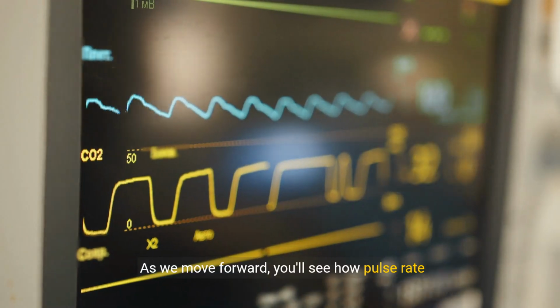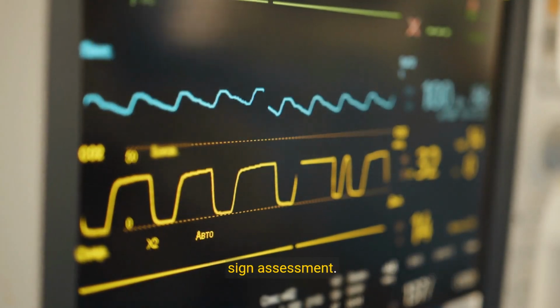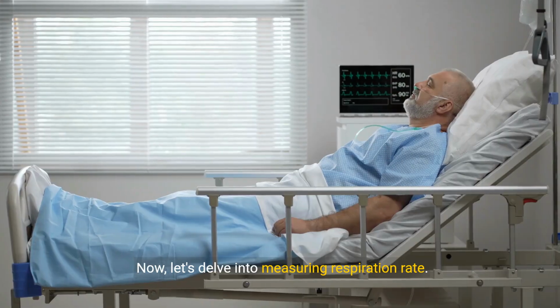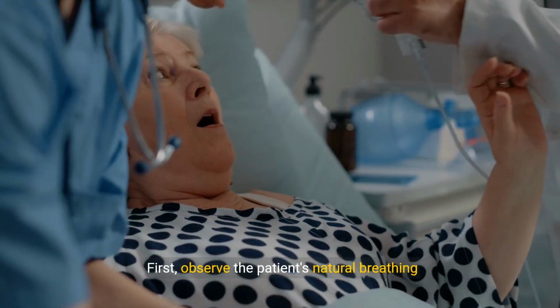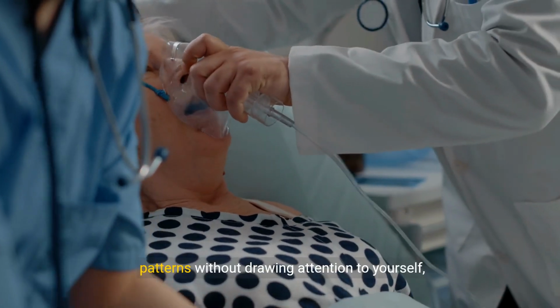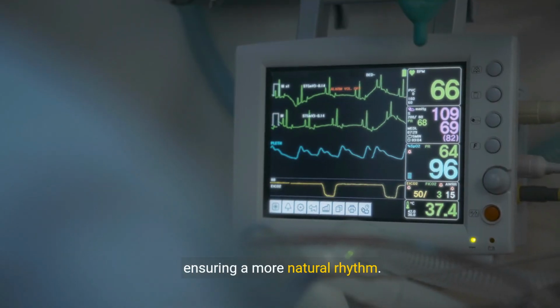As we move forward, you'll see how pulse rate measurement ties into the larger framework of vital sign assessment. Now, let's delve into measuring respiration rate. First, observe the patient's natural breathing patterns without drawing attention to yourself, ensuring a more natural rhythm.